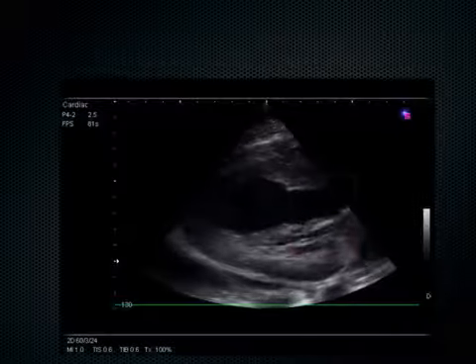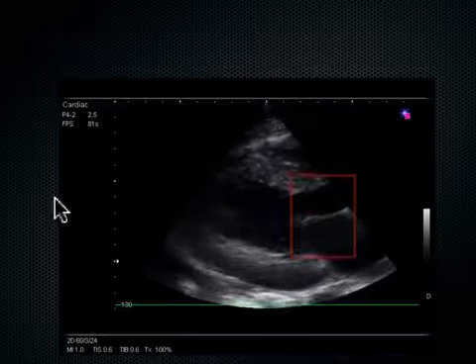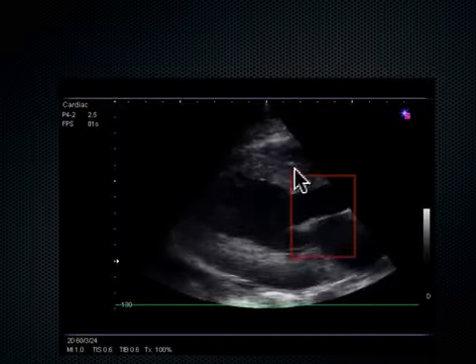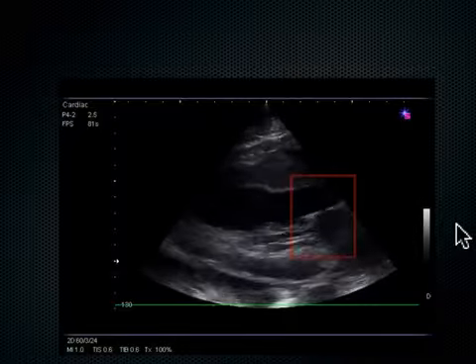Okay, what about this? How's that septal wall doing? This isn't the best view of the heart, but even though it's a little squished, I'm not seeing it come up here to the septum. Okay, so right off the bat, there's a problem.